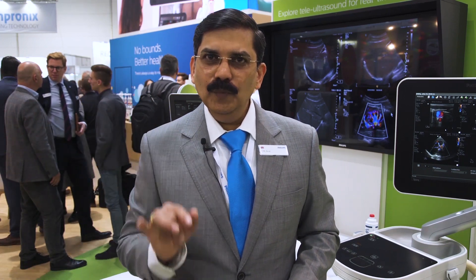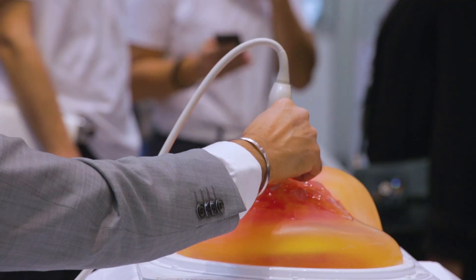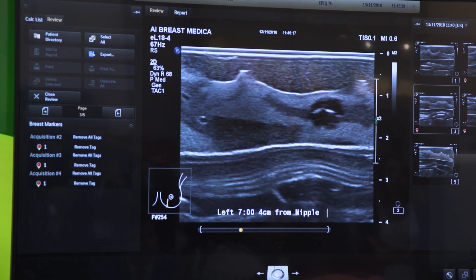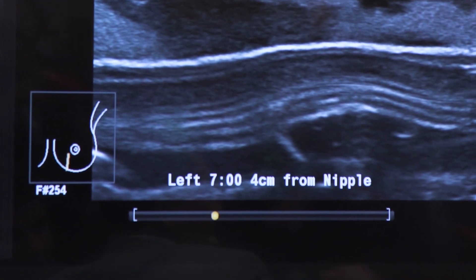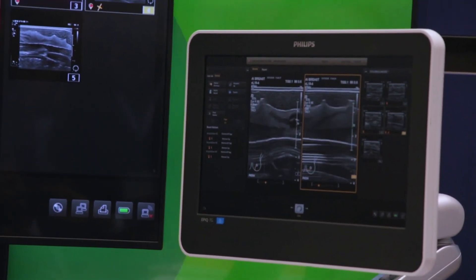Once I complete the entire breast area, I can pull out one of the loops I've acquired, scroll through the loops, and get a particular image. In this image, as you can see, there is a pathology. In a normal case with a conventional system, you would have to label this pathology manually. But on the Philips system with AI Breast, there is a feature called auto annotation — with just one click, the system can label this image. At this point, with just one click, the system can also give me an orthogonal view and display both perpendicular views in a side-by-side format.